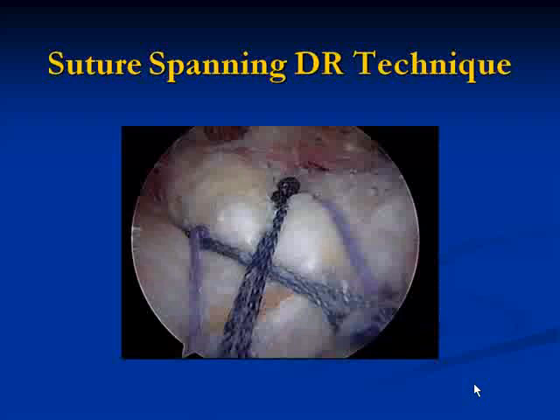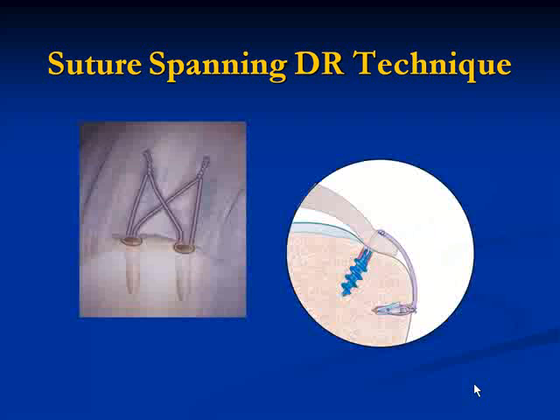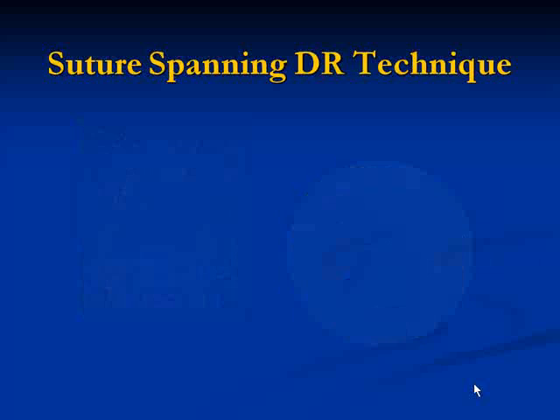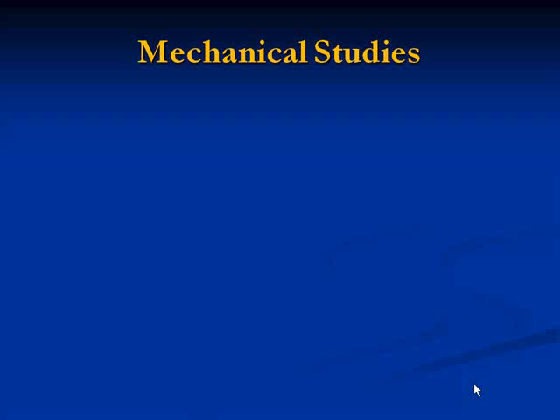And even more recently, the standard double row technique has undergone some innovations, and we see some experts suggesting that a suture spanning method is even more superior to a standard double row technique. And this is where we have a medial and lateral row and suture spanning in between the rows. It's also been known by a number of other names such as suture bridge and a transosseous equivalent technique as well. These are all referring to the same thing.